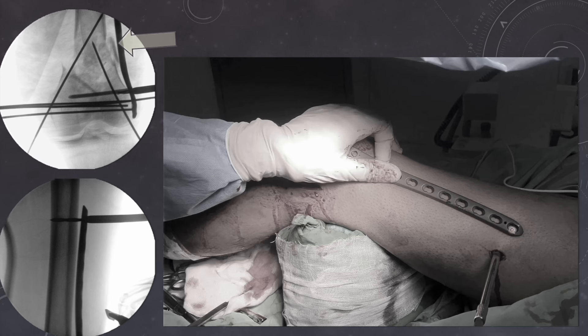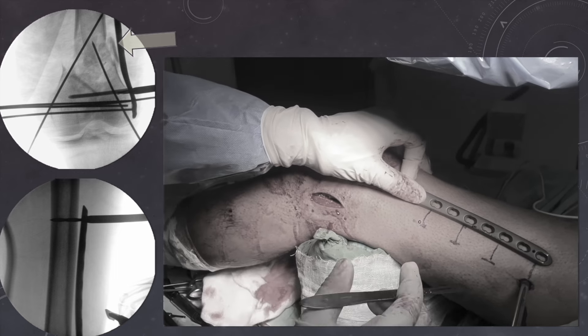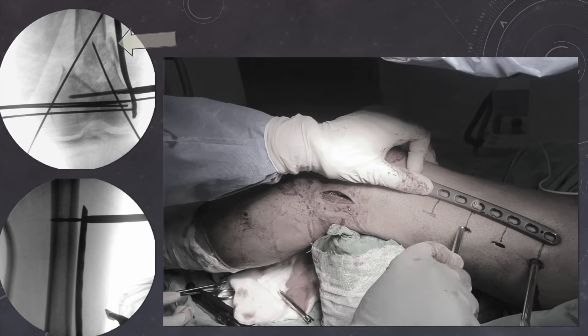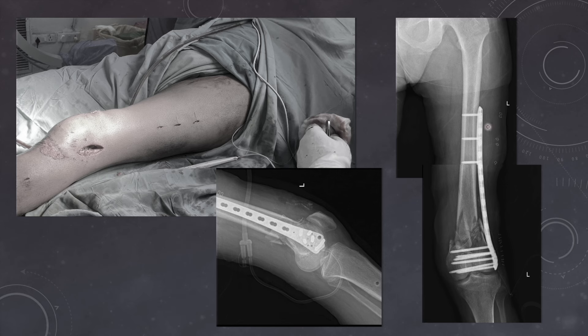Since we have already placed a locking sleeve in the proximal part, we can use another locking plate to mark the areas for the remaining locking holes. To maintain 50% screw density in the diaphyseal part, we keep the alternate holes vacant and fill the holes in between with screws. We have marked the locking holes in which we want to place the screw while maintaining 50% screw density. Here the bone quality is good, so we will be placing only 3 locking screws in the proximal segment. We give a stab incision, then using a locking sleeve we bluntly pass it inside the locking hole and tighten it. Once the locking sleeve is placed, we drill the track and put the screw inside.